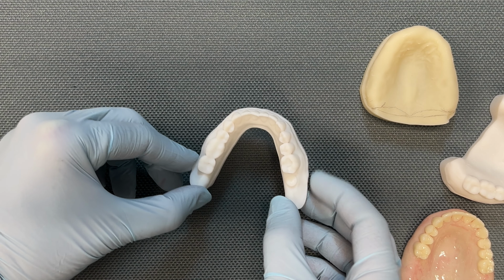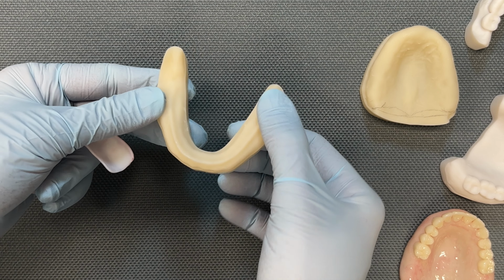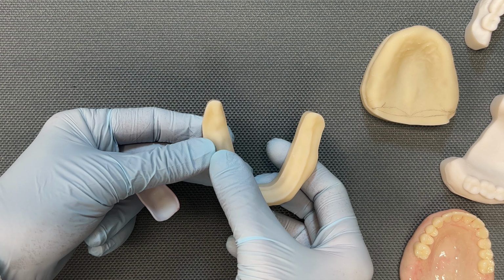Now, on the lower arch, this is always the more difficult one. So again, this is my mouth. We're going to digitally remove all of the teeth, and then we've got this ridge, and if you can imagine, over time, this ridge is going to resorb.